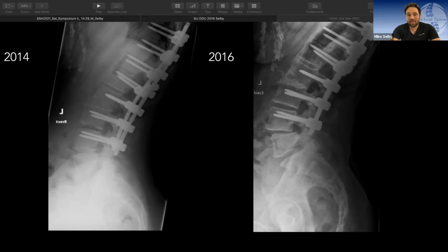2016, you're 3 years down the line, you've got this X-ray. Yeah, I think we can see these more and more often. I don't know, how negative is the SVA? Was it like 2 centimeters? So she's basically as she was before surgery.